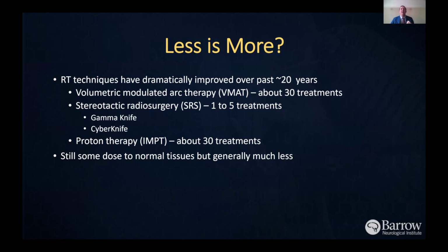But there is some thought that maybe there is some lower dose to the nearby carotid arteries or the hippocampi that control short-term memory, potentially a lower risk of the extremely rare but potentially life-threatening radiation-induced cancer. These studies are often compared to some of the older techniques with prior X-rays, because actually proton therapy has been around since the 70s or 80s. It has fortunately become much more available throughout the country. There are about 30 proton centers in the US now.